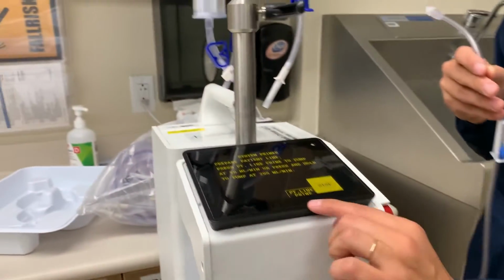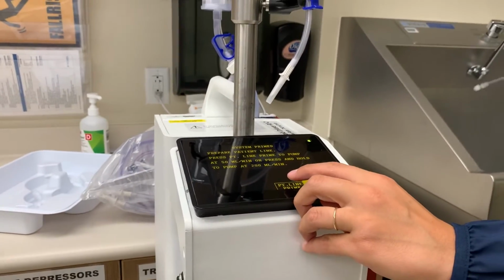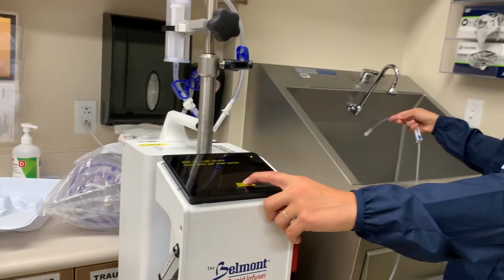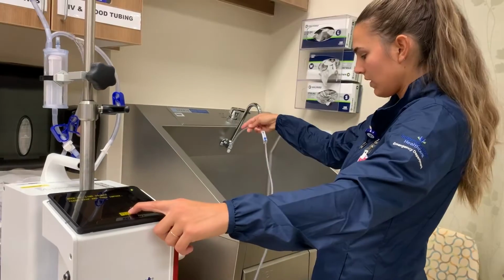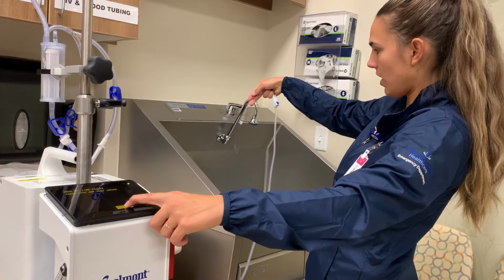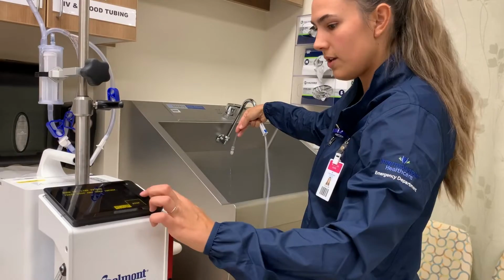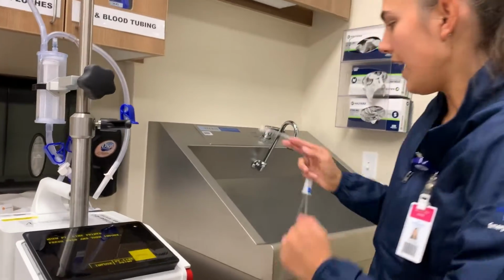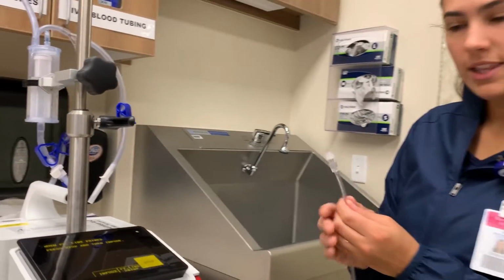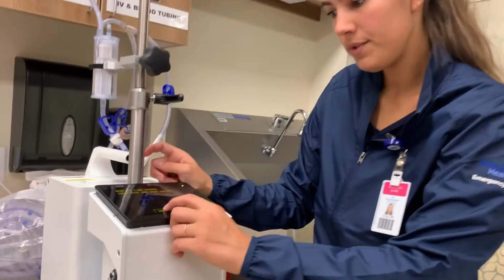The next thing you're going to do is select patient line prime. Once you select that and hold it down, you can see the fluid coming. Now it's going to officially prime up to where you would connect it to the patient. So I'll say stop. And now we're going to connect it to the patient at this point. And then you can say infuse.